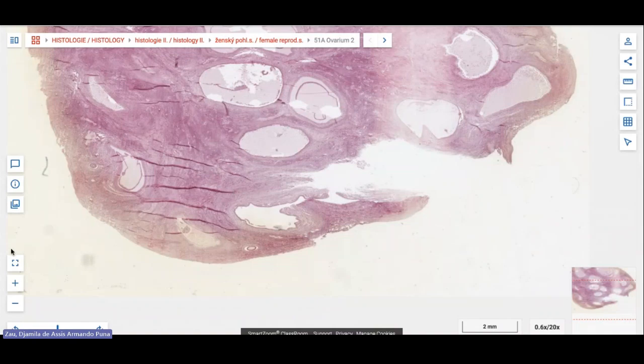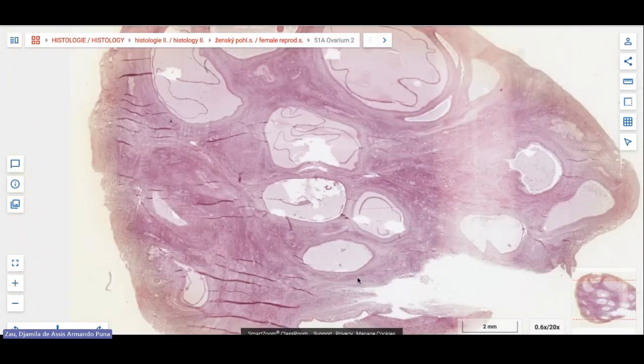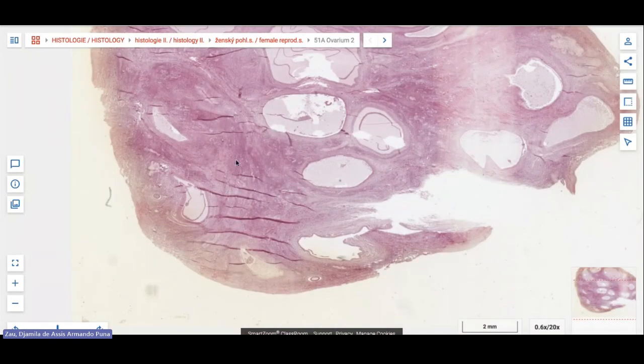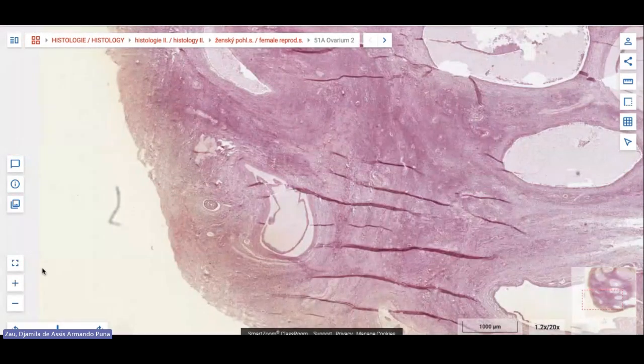So it was actually pretty difficult for me to find some other smaller follicles in this slide. I don't think it's a very well cut slide. The good thing is that for your slide test, you will not have to go looking for the follicle. The professor will find it for you and then just ask you what it is.